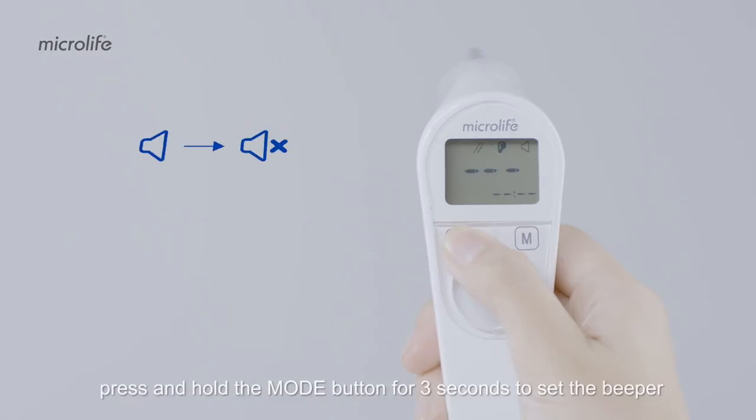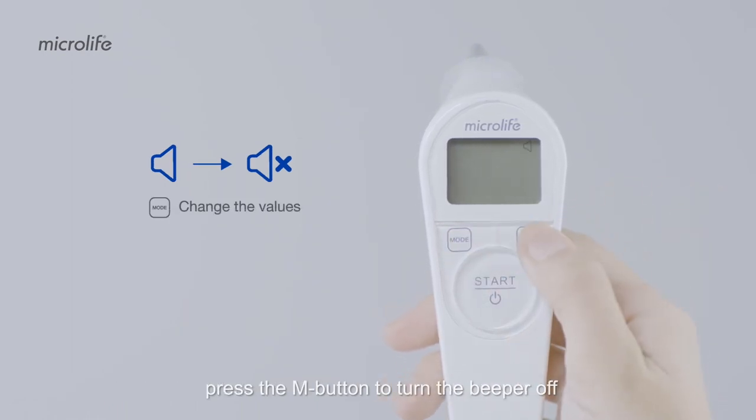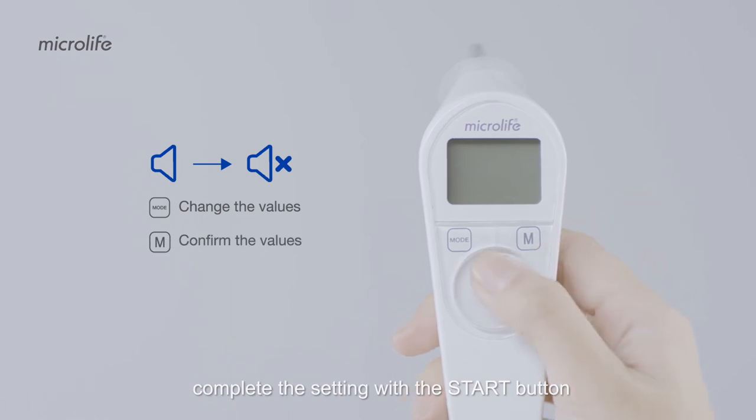Press and hold the mode button for three seconds to set the beeper. Press the M button to turn the beeper off. Complete the setting with the start button.